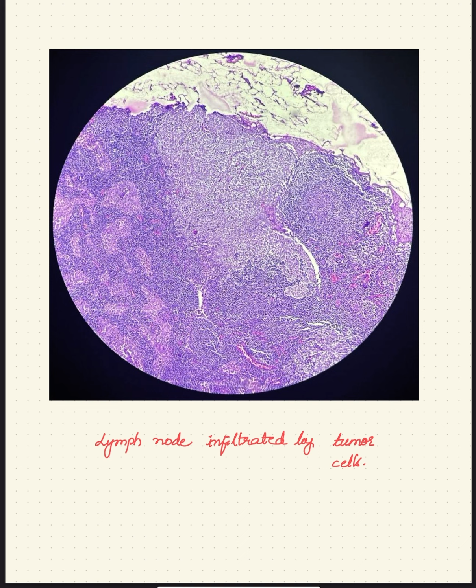This is one of the lymph nodes showing infiltration by the tumor cells.